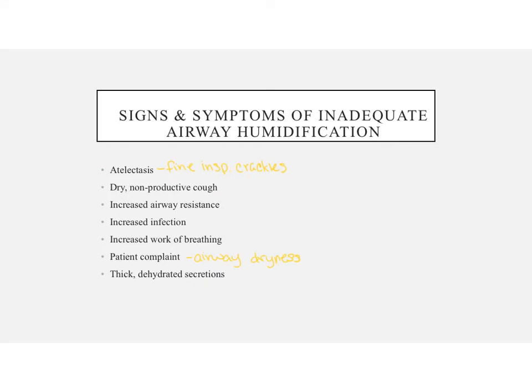Humidity requirements at various sites of oxygen application. So if we are giving them oxygen at the nose or mouth, the body is going to require 50% relative humidity with an absolute humidity of 10 milligrams per liter on room air.